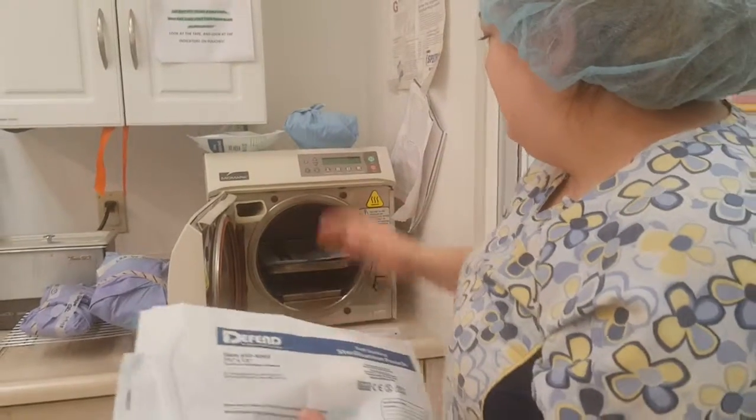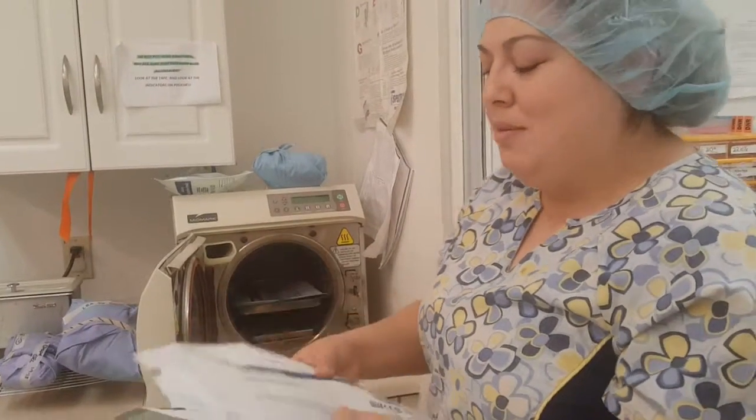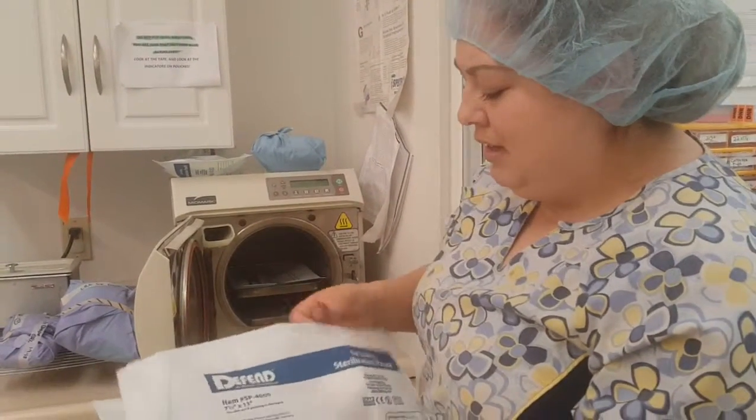You don't want to stack stuff on top of each other because the steam won't rise and you won't be able to get things sterilized properly.